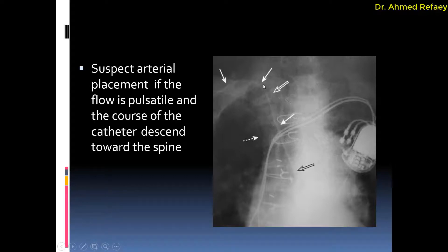Another example of malpositioning of the central venous catheter: inserted through the right subclavian vein, but there is pulsatile flow, suggesting it may be malpositioned in the artery. Also notice the course is oblique, going toward the spine rather than parallel to it — so this is arterial placement of the central venous catheter.